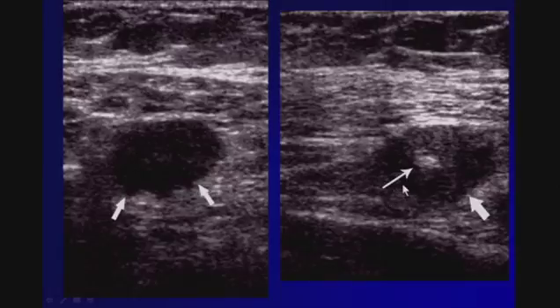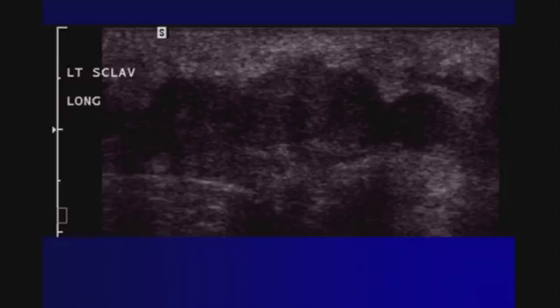On this side, we're going to do the biopsy of this lymph node. Here's our biopsy needle in the node, and we're doing the FNA. So notice our needle coming through the pectoralis muscle here. If we're doing this biopsy, we want to give quite a lot of local anesthesia here. And then we biopsied this lymph node. This was positive, so this was evidence of N3 disease with involvement of an infraclavicular lymph node.